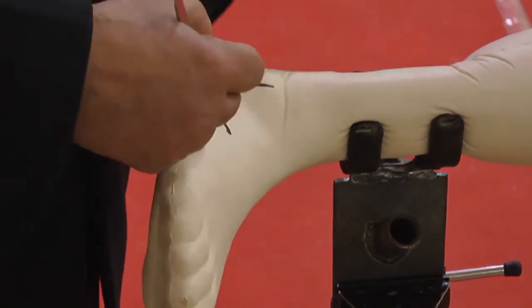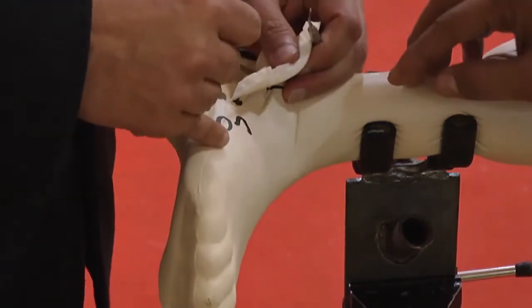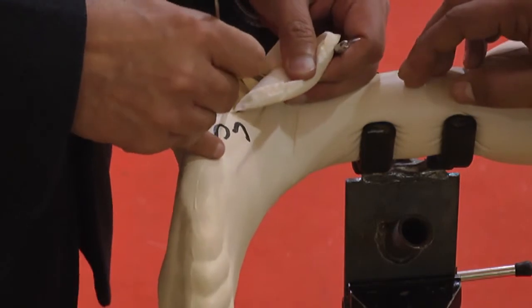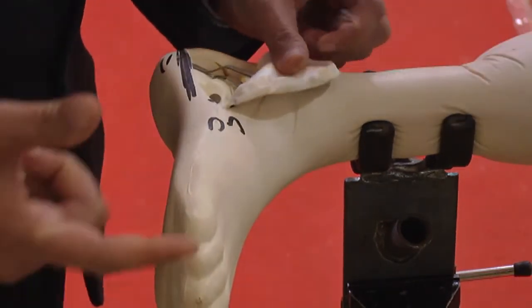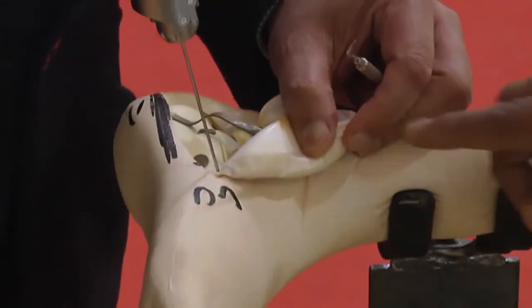Now the first step after this is to put the K wires for the retractors. So we'll put the first wire, and the first wire goes into the cuboid.